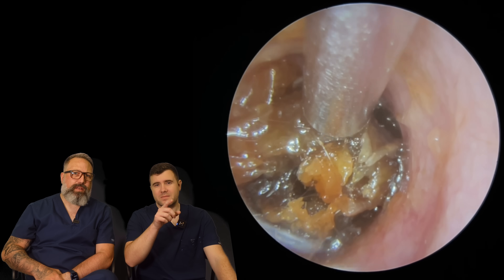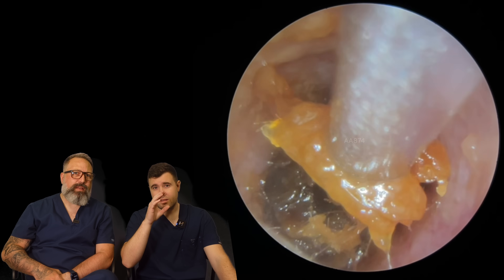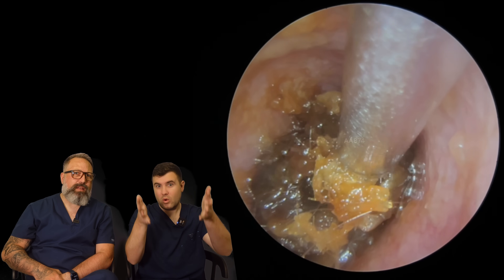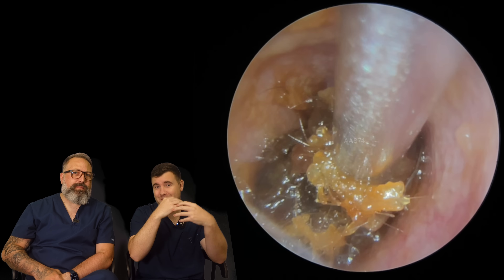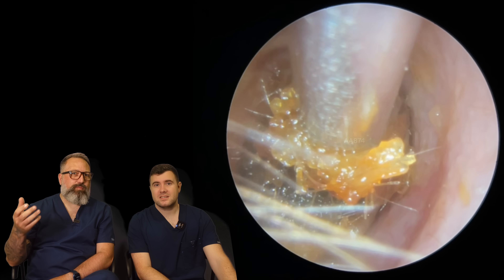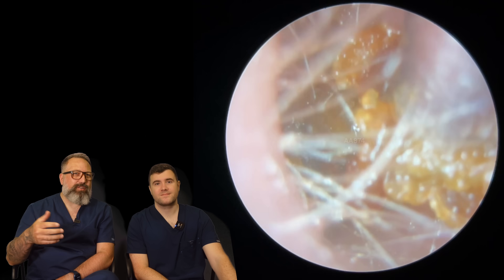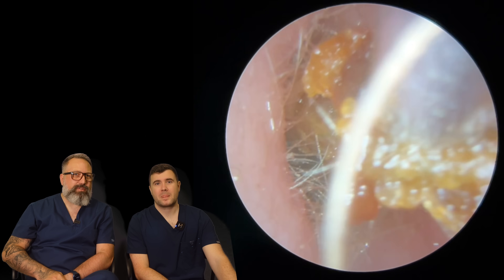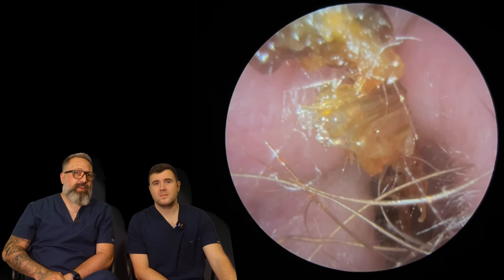And that's normally the downside of using oil. You could see at the start there the oil was stuck to like the walls of the ear canal — the haze in there — and it was just rubbing up against the camera so it blocks our view. This is why sometimes when we've got dry wax we always weigh up whether putting the olive oil in might help, but it might also affect the visual, so you always take it on a case-by-case basis. But coming away nicely — a big thick kind of ribbon of keratin.